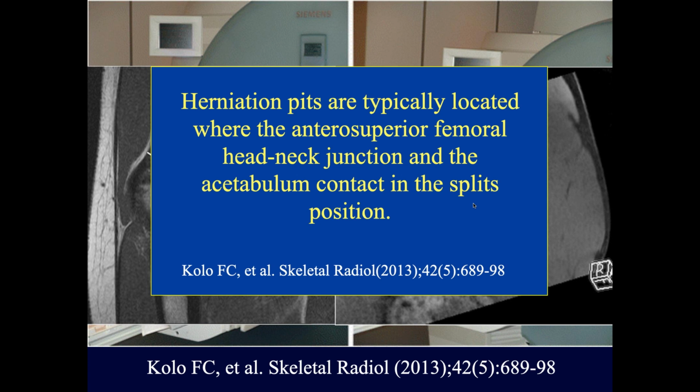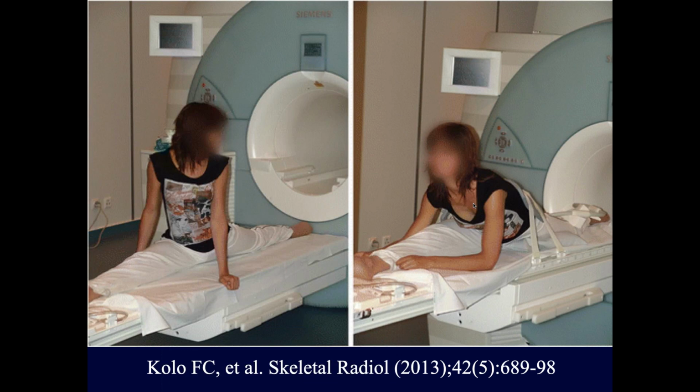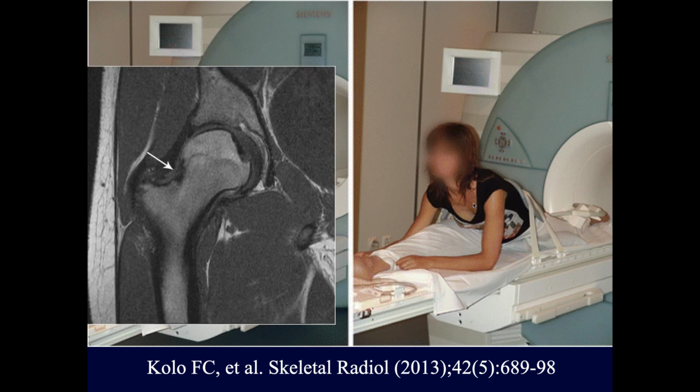This particular patient that was in this study was not painful at all. Without an anesthetic. Without an anesthetic, yeah. Okay. It'd be interesting. So, capsular injury on that one? Looks pretty thick. It's thickened probably because she does a lot of activity that stretched it and it's kind of repaired itself and become thickened. Yeah.